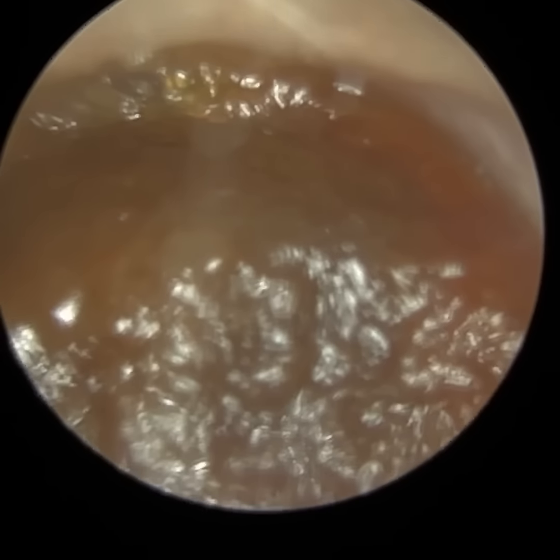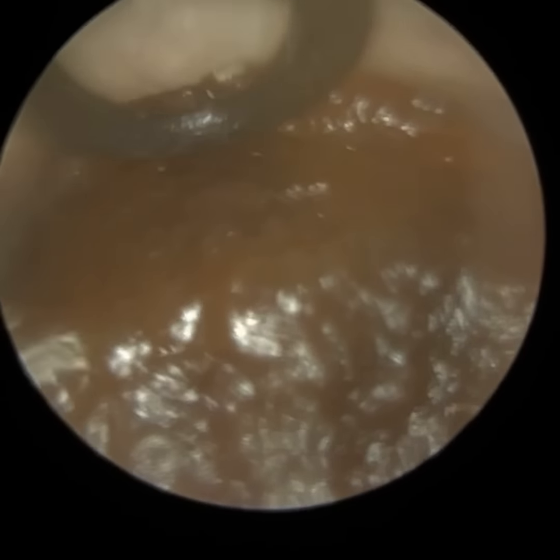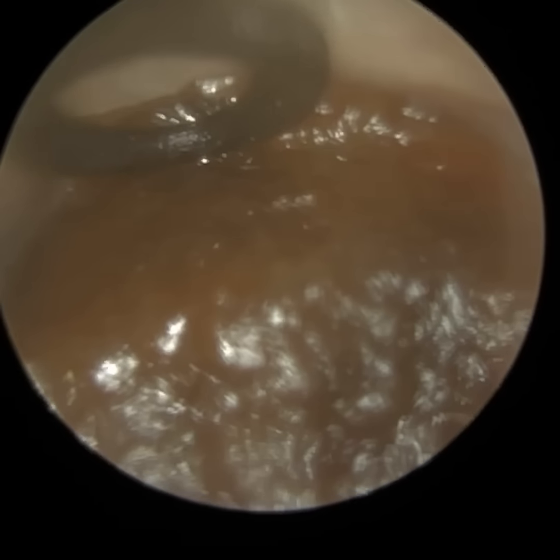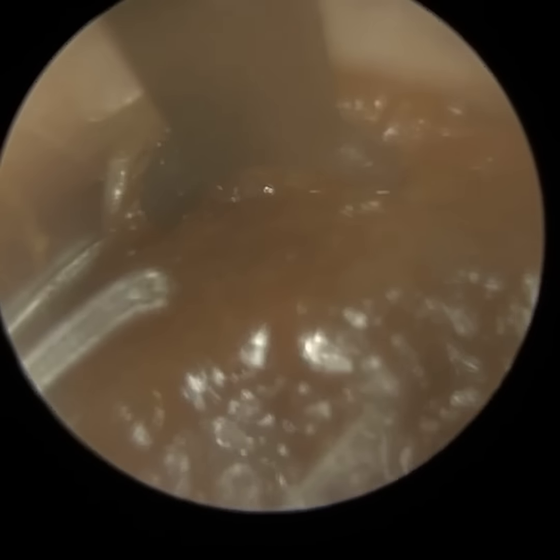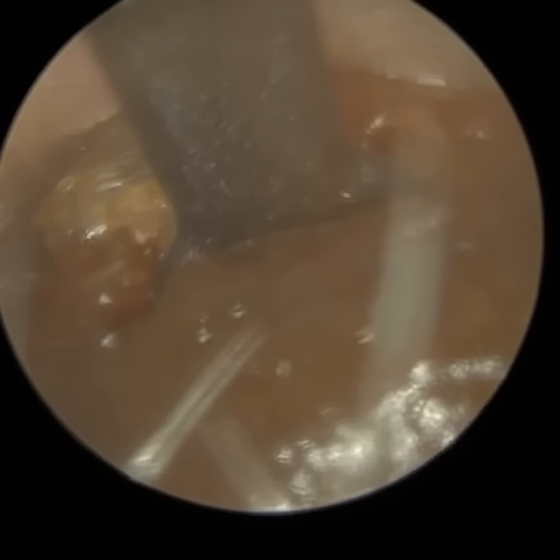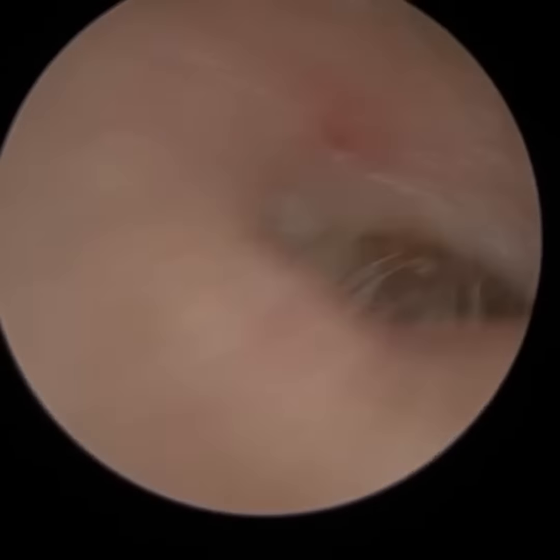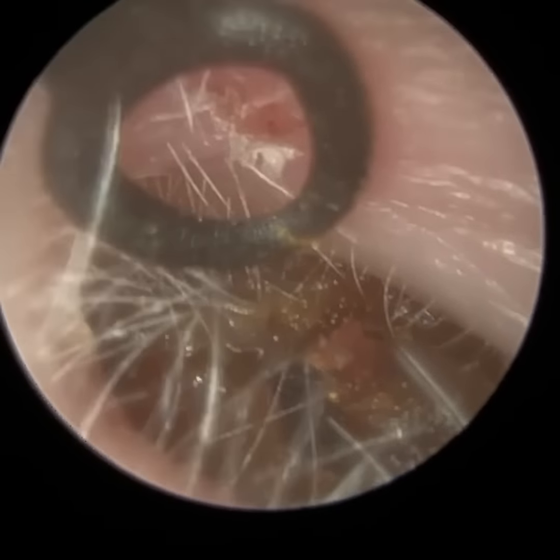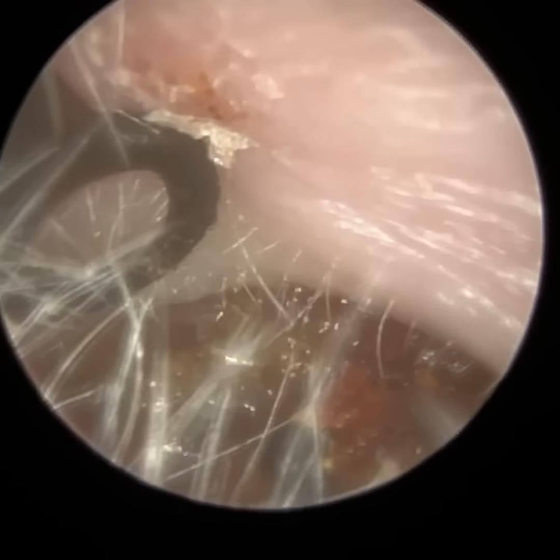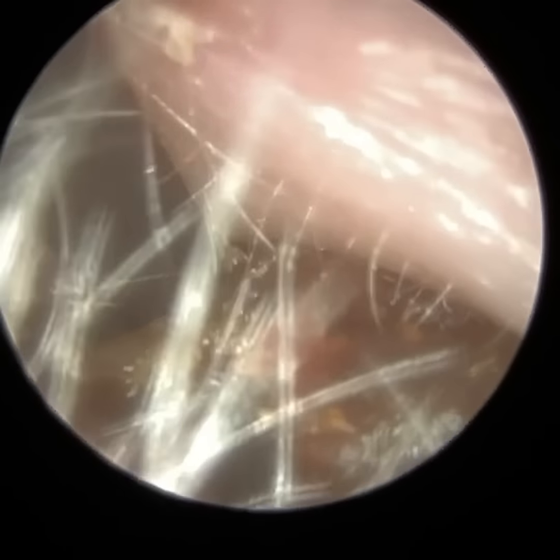Here we have a patient who attended with bilateral occluding earwax, and I'm commencing with the right ear first. I've decided to use the right angle curette — there's a nice semi-opening at the roof of the ear canal, and I've just embedded the tip of the right angle curette into that. As you can see by the angulation of the curette, I'm pulling this out whilst meandering around the natural contours of the ear, as our ears are not straight cylindrical tubes.